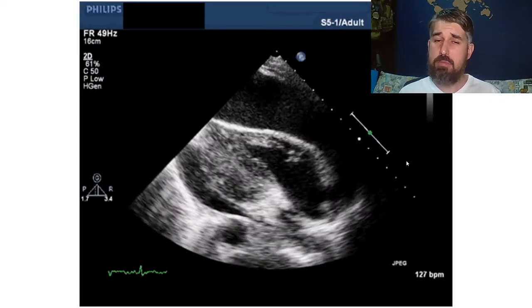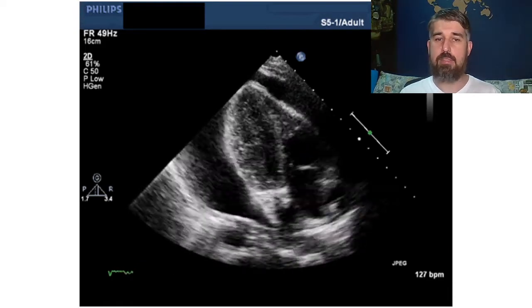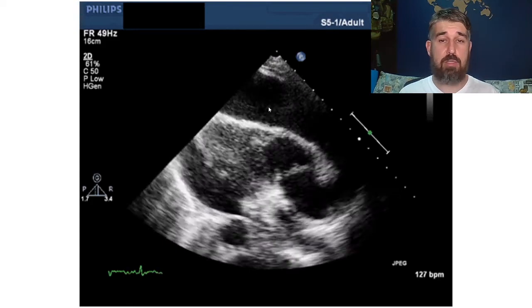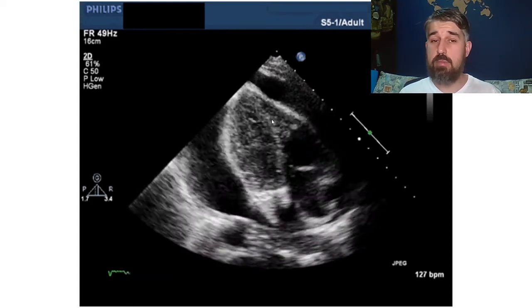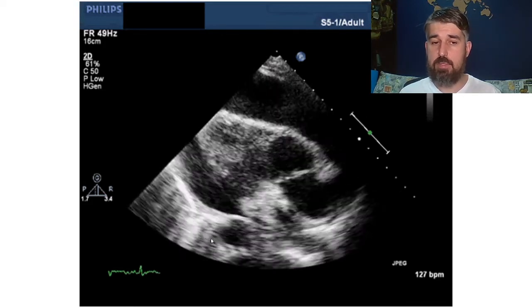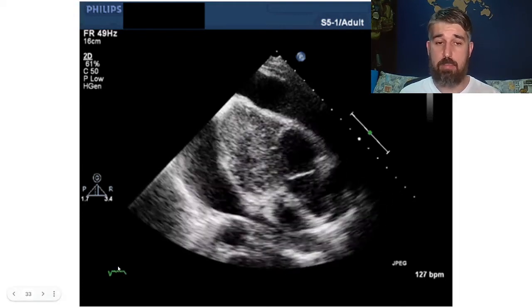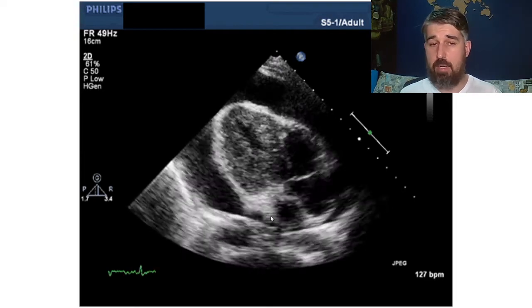What we don't expect to see, or at least what we don't hope to see, is this. The heart not pumping very well, a little bit lazy, not very good, and a lot of free fluid around it. Also, we can see alternating polarities on the ECG. So this is a cardiac tamponade.